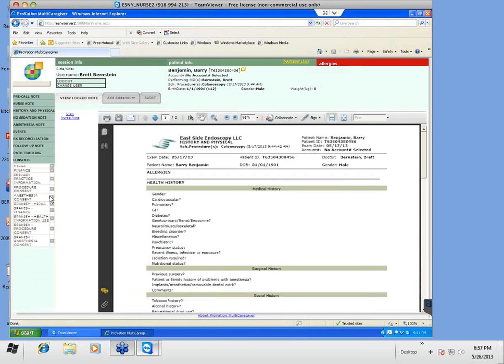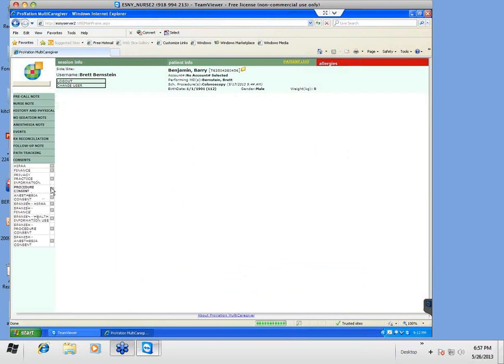For those of you performing procedures at an ambulatory center, as you know, the consent forms are done prior to the procedure electronically. The hospitals at this time are currently using paper consent forms, but we hope to soon have electronic consents available. The consent forms are available electronically both in Spanish as well as English.